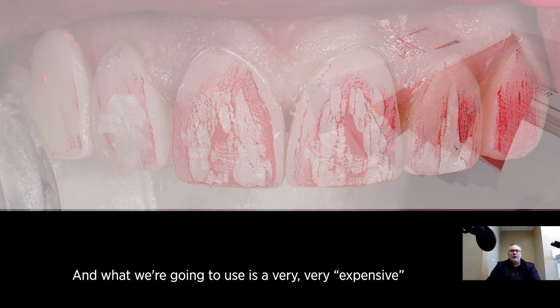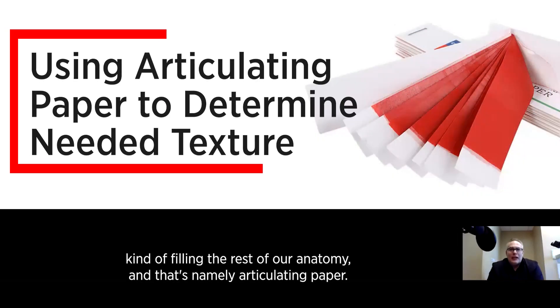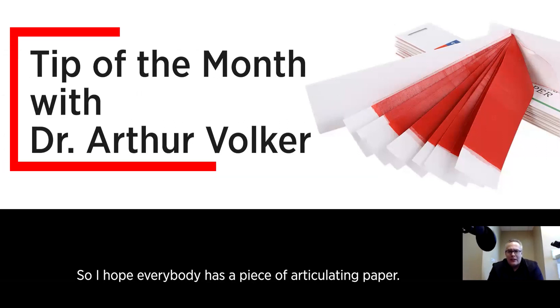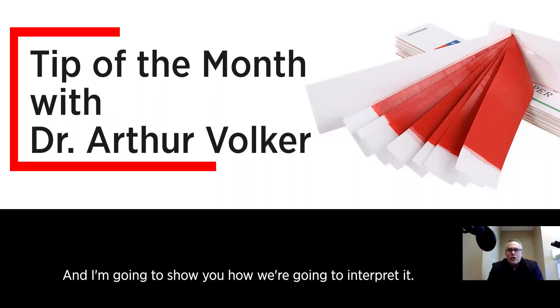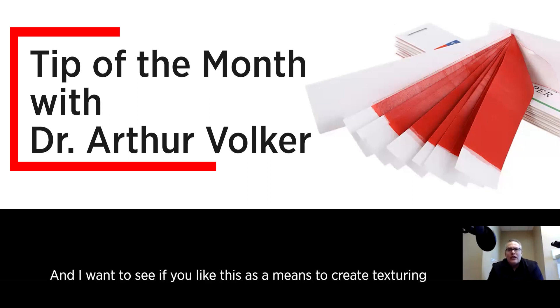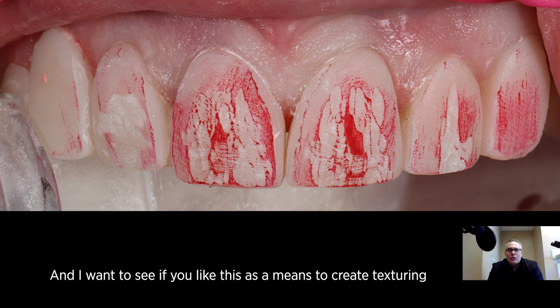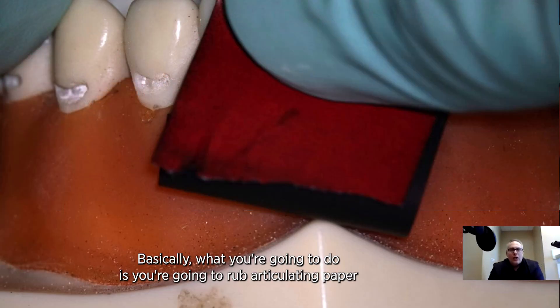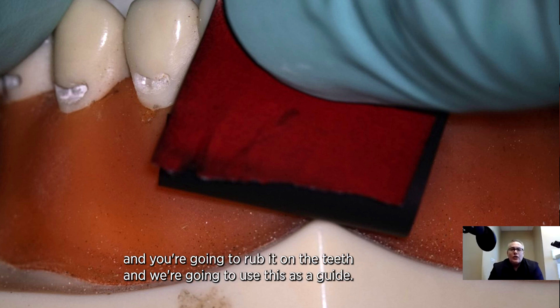We're going to use a very expensive piece of equipment to help fill in the rest of our anatomy, and that's namely articulating paper. I hope everybody has a piece of articulating paper, and I'm going to show you how we're going to interpret it. I want to see if you like this as a means to create texturing in your restoration. Basically, you're going to rub articulating paper on the teeth, and we're going to use this as a guide.